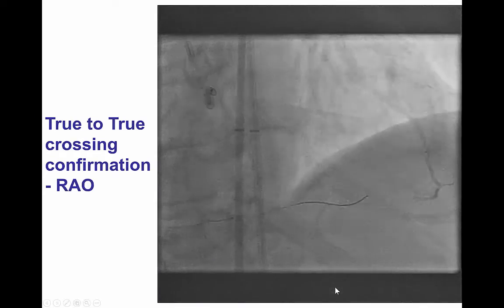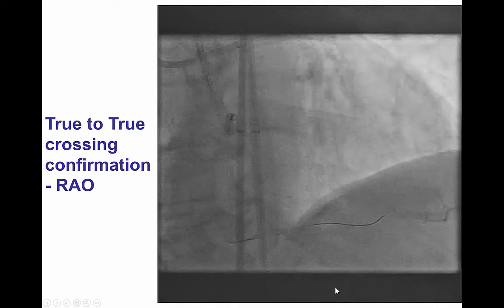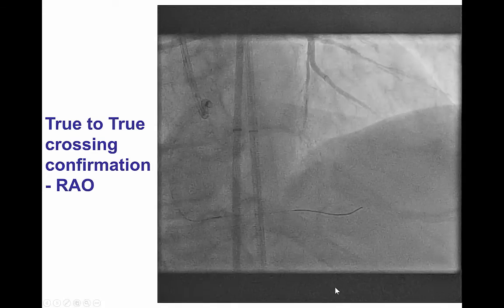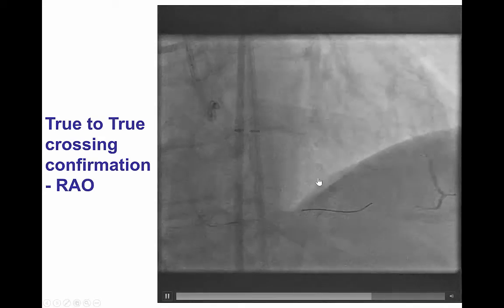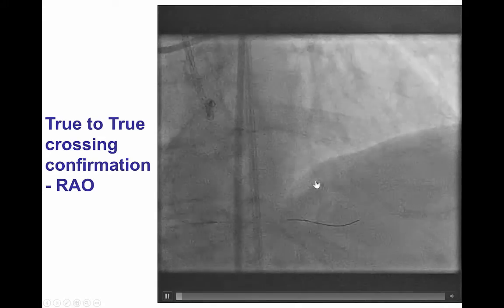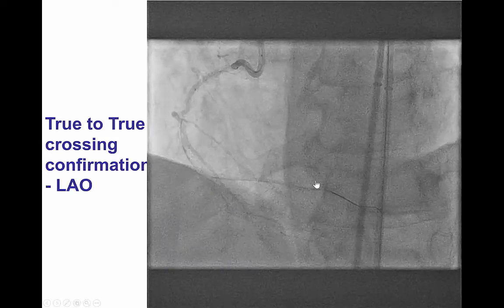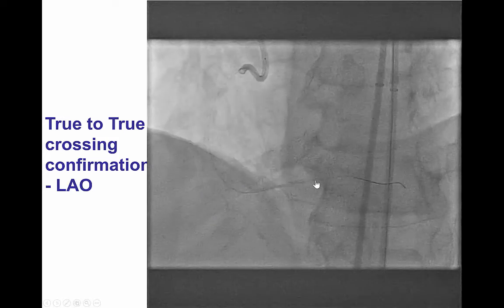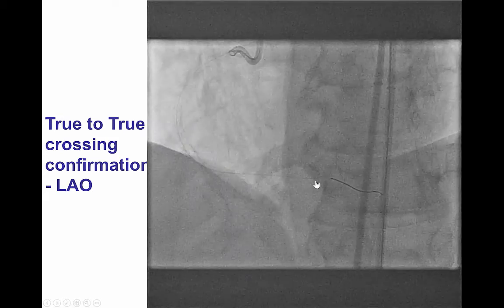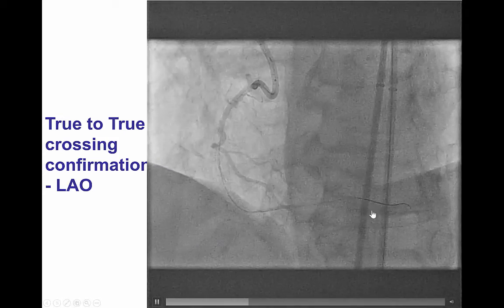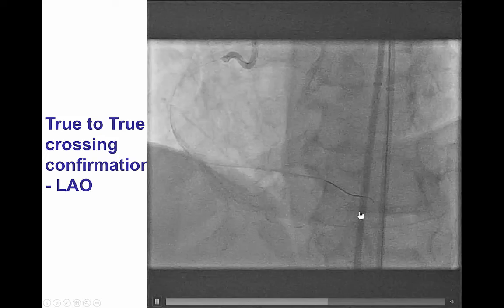Then we were able to advance a guide wire to the PDA, as confirmed from contralateral injection as well as orthogonal projection, so indeed we have a wire to the PDA.